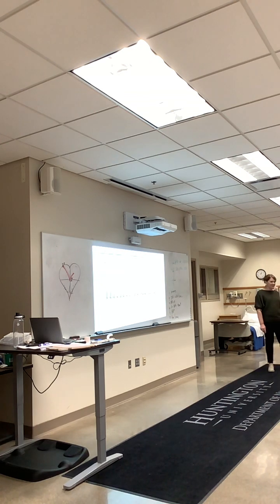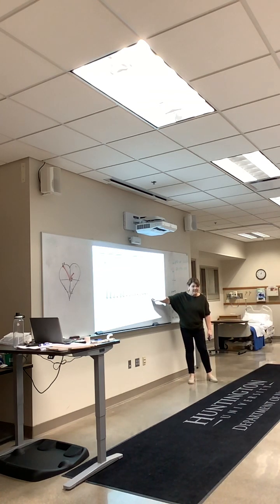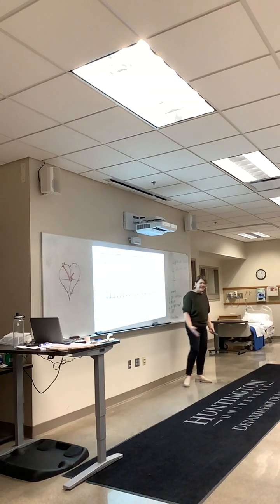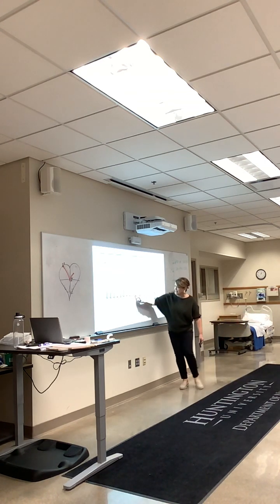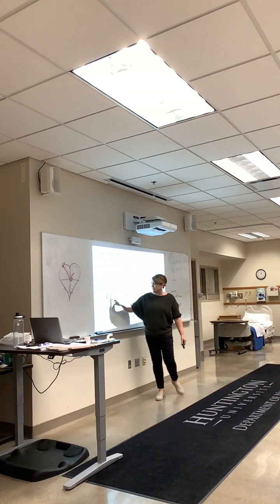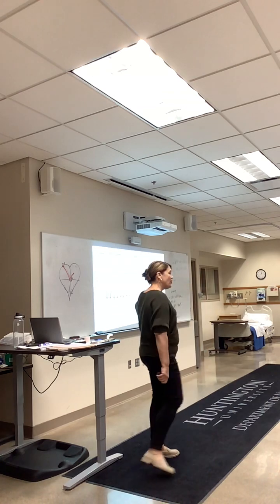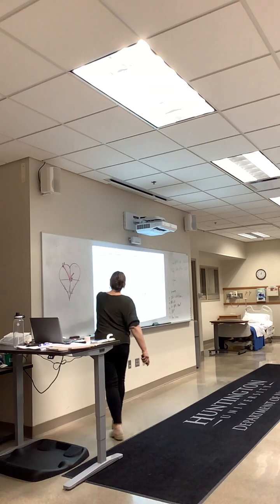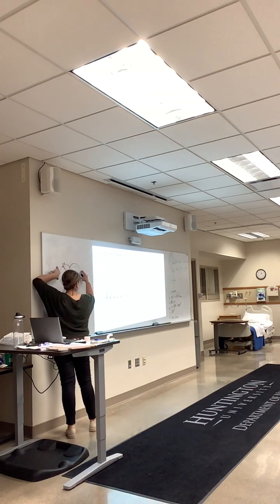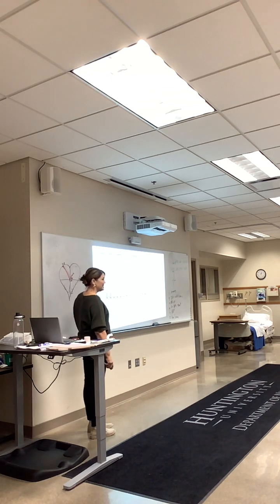All right, kind of, sort of. Here's another example of that. Can you still see your P wave? Barely. The rate's up there. Does anybody want to calculate my rate? 1, 2, 3, 4, 5, 6, 7, 8, 9, 10, 11, 12, 13, 14, 15, 16, 17, 18. So that's 180. As your rate gets higher and higher, it gets harder and harder to see my P wave. But I can still tell it's a P wave, so I still know it's somewhere in my atrium. I just can't see what it looks like.